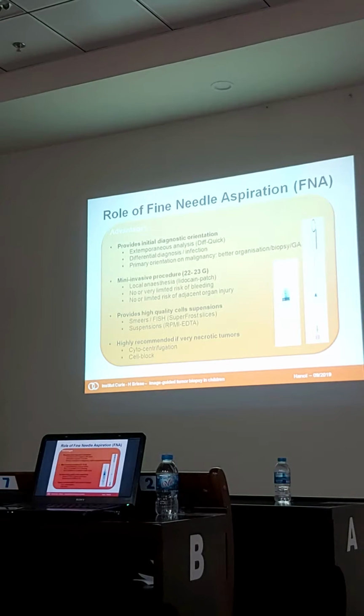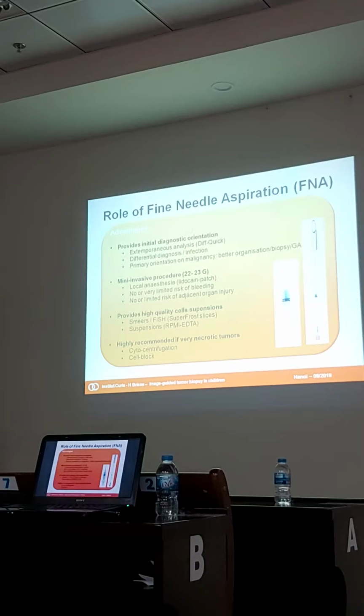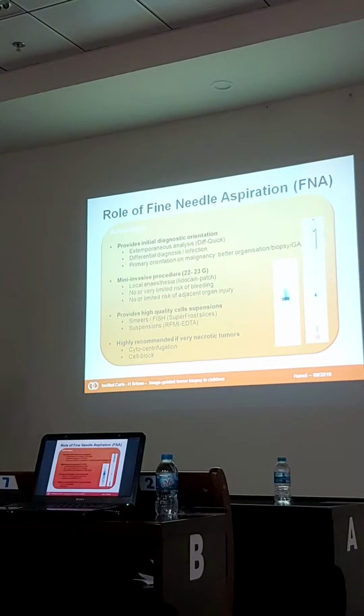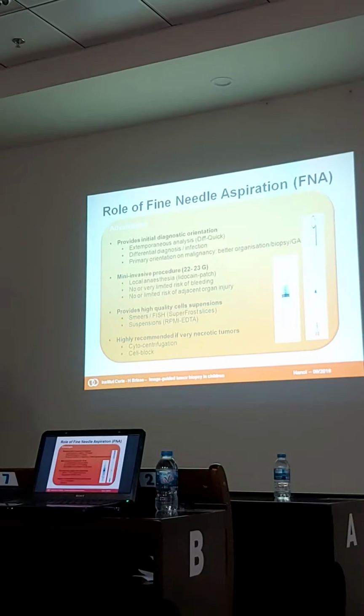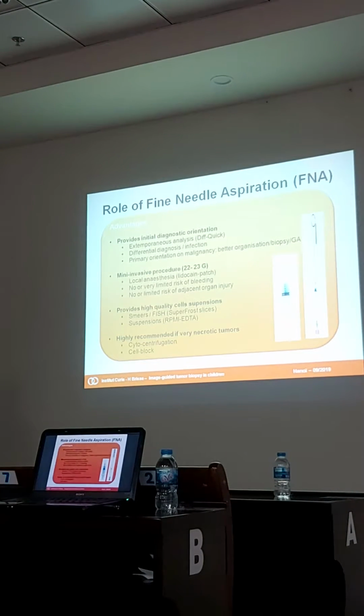In children, we use also a lot of fine needle aspiration, which is another method. It is not the most important one. The most important one is biopsy. But in children, sometimes we use also fine needle aspiration. It provides much less tissue.